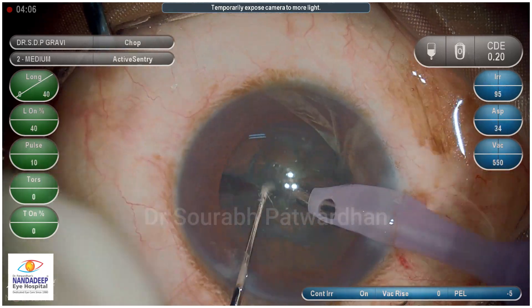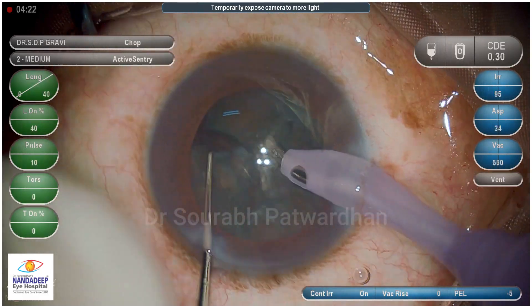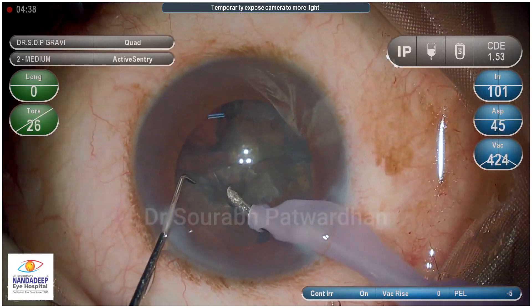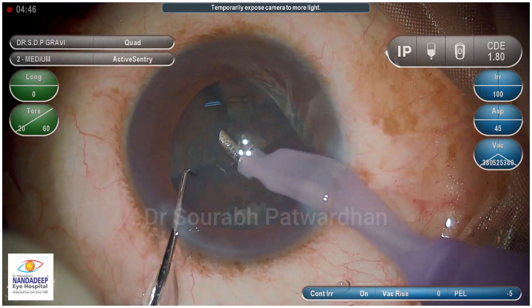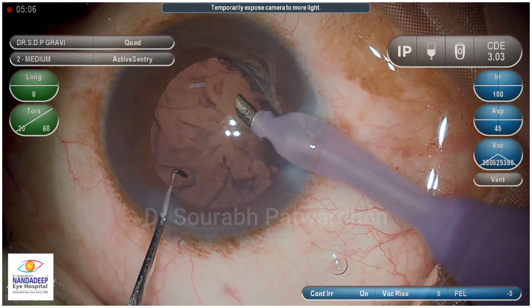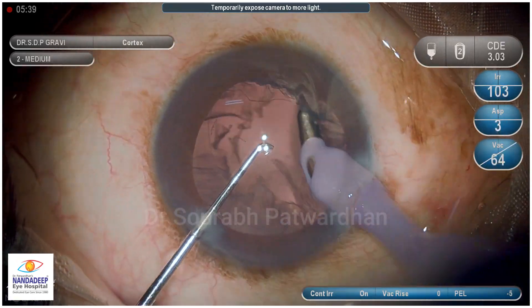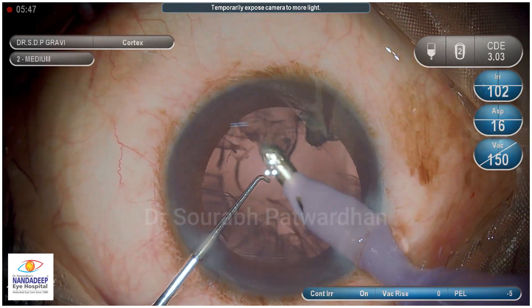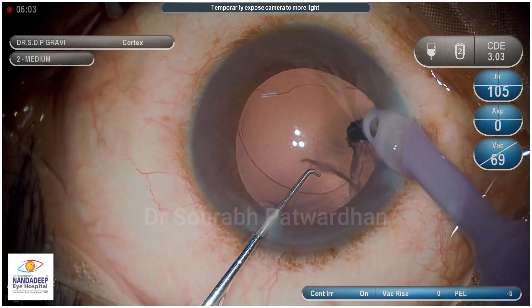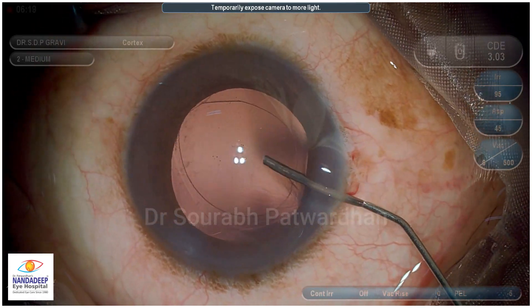The cataract was grade 1. I could do primary chop and remove the nuclear pieces easily, so that was not difficult. Now, when we place the IOL in the bag in this case, there will be an area where it may not be covering the optic. Sometimes if you have a bigger IOL like a plate haptic IOL, you can place the haptics in that area.